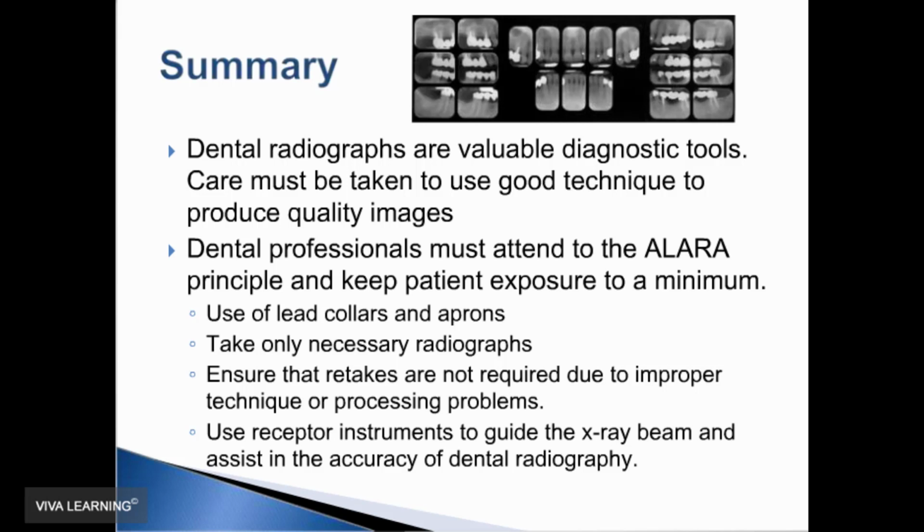And this can be accomplished by being familiar with the principles of paralleling and bisecting angle technique, how to correct errors, and the use of receptor instruments to help us produce consistent results with fewer errors.